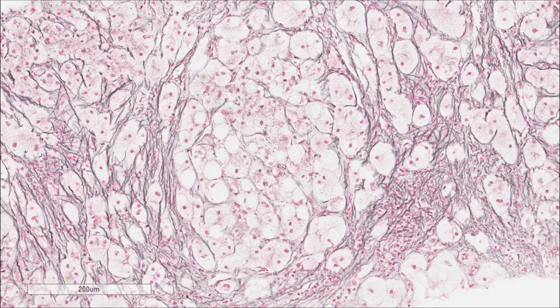Here is a reticulin stain to make the point once again that in fatty liver diseases, the reticulin framework around those steatotic hepatocytes may not be complete, and one does not want to misinterpret this as hepatocellular carcinoma. Do not misinterpret this as macrotrabecular architecture. So be careful about interpreting reticulin stains in a steatotic liver.